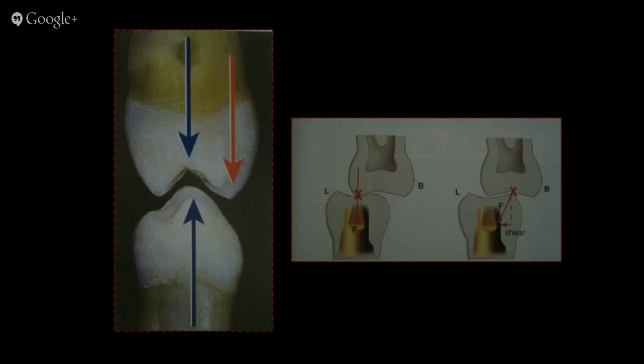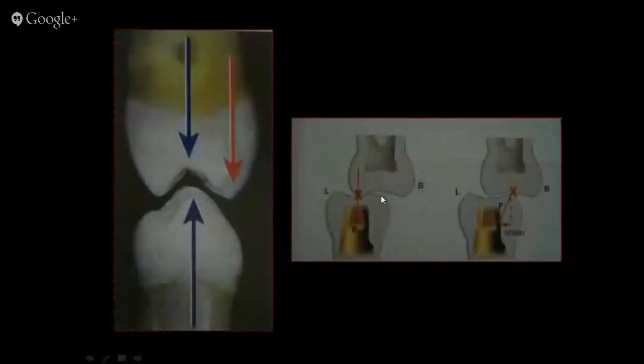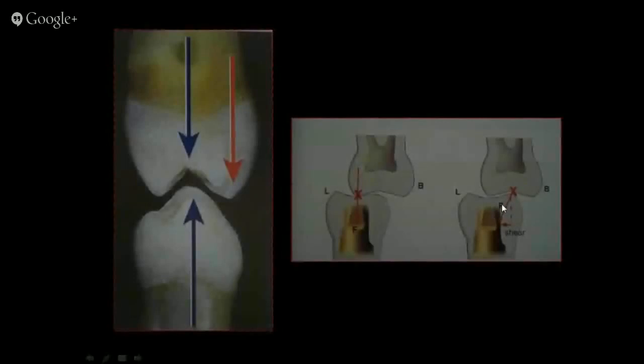What about the marginal ridges? If this is where my implant head is and an abutment over it, my marginal ridges would be here and here. If these points are getting contacted, they are at an angle to my implant body or an abutment overlying it. So these again cause non-axial loading, shear stresses, tensile loading, again going to cause stress concentration.